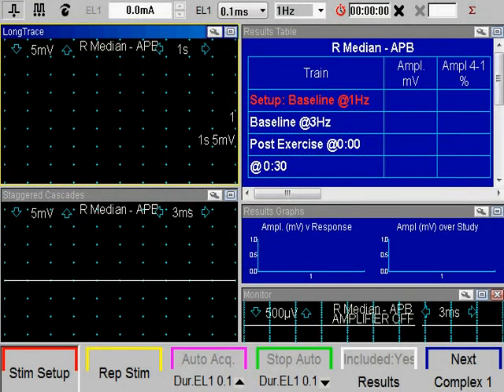Repetitive nerve stimulation. Connect the recording electrodes to channel 1 inputs of the amplifier and turn on the amplifier if necessary. The monitor trace shows the signal baseline. It should appear flat, indicating minimal noise and interference. As we enter the test, we are in the Stim setup mode.